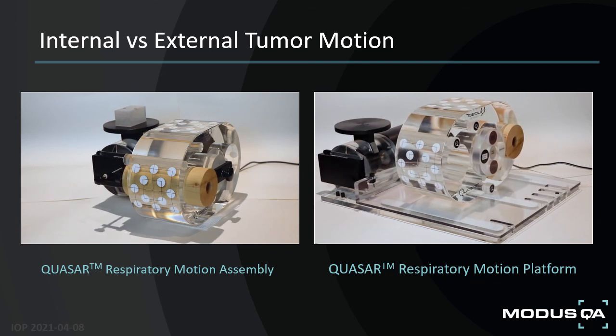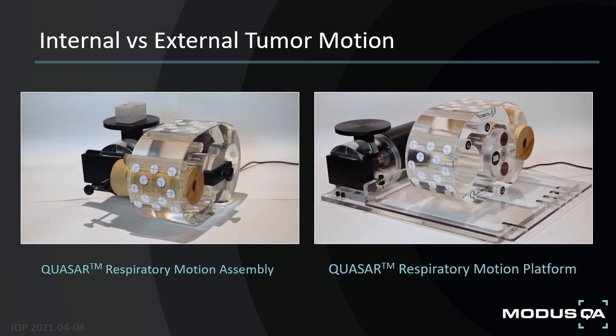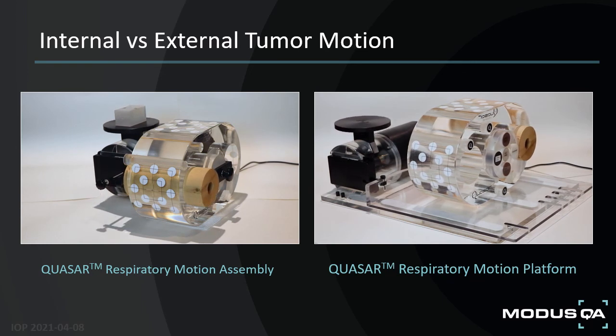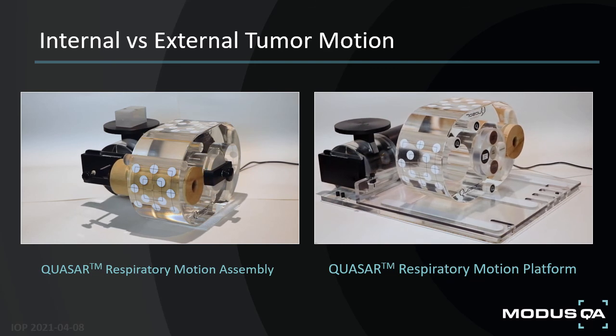So all in all, both the QUASAR Respiratory Motion Assembly and the motion platform are viable options to simulate respiratory motion for treatment planning and treatment delivery QA. It just really depends on your testing question in mind as well as your personal preference.